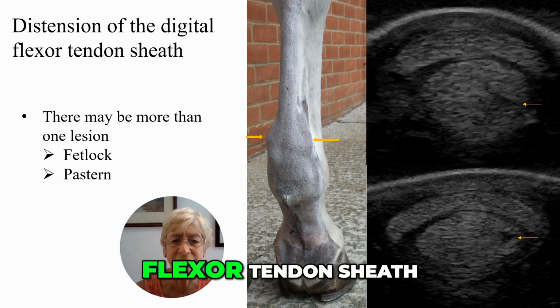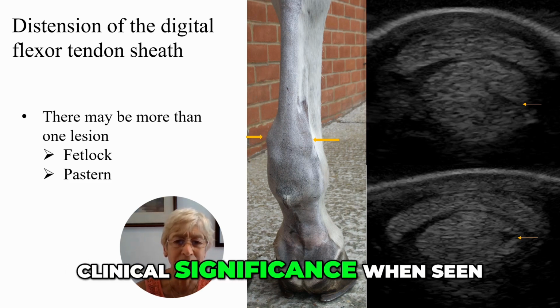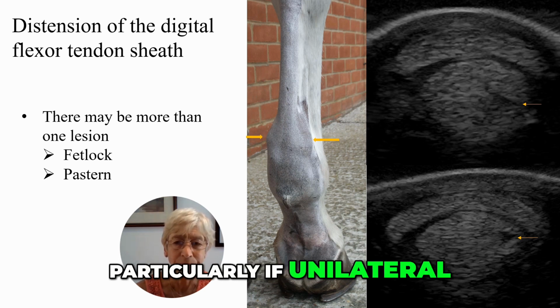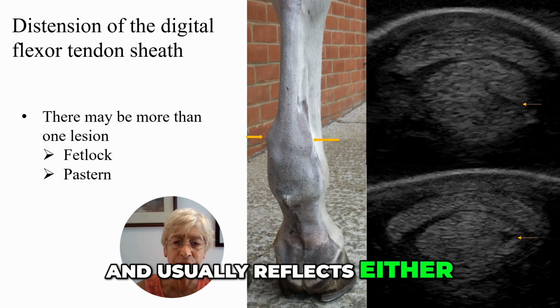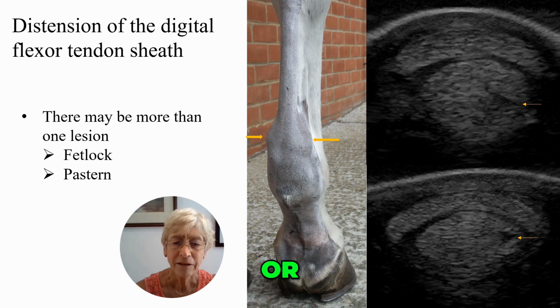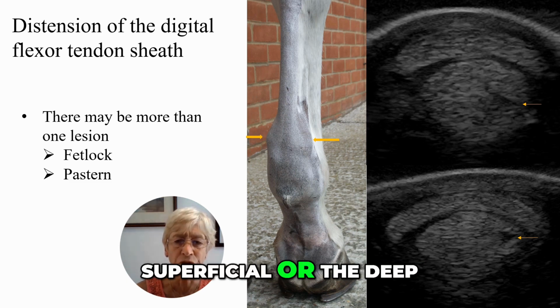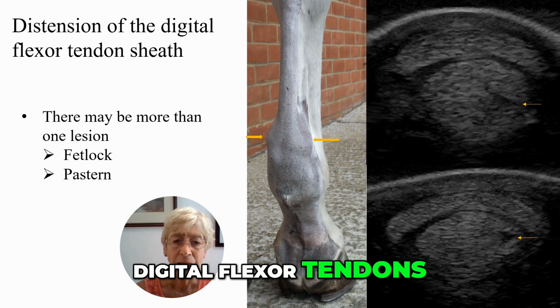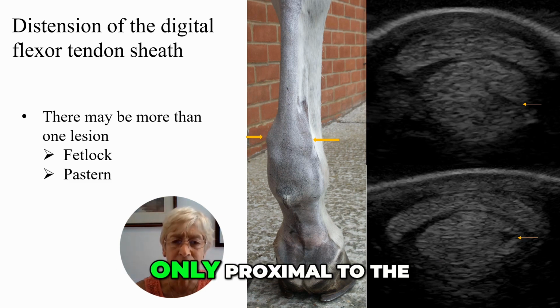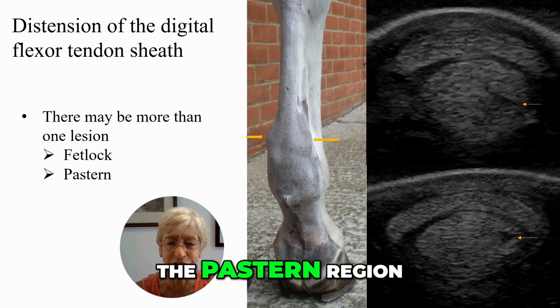Distension of the digital flexor tendon sheath is almost invariably of clinical significance when seen in forelimbs, particularly if unilateral, and usually reflects either primary tenosynovitis or synovitis secondary to a lesion of either the superficial or the deep digital flexor tendons. Bear in mind that the digital flexor tendon sheath is present not only proximal to the fetlock, but also distal to the fetlock in the pastern region.